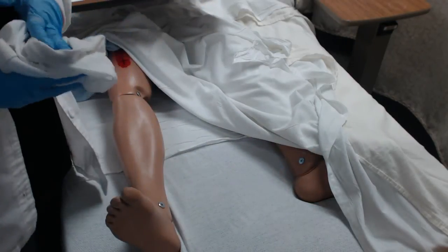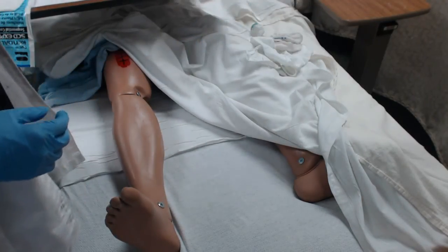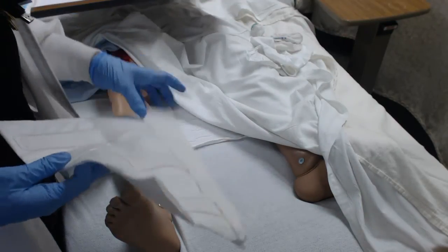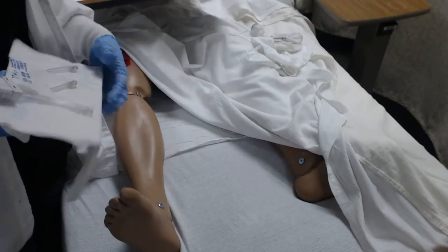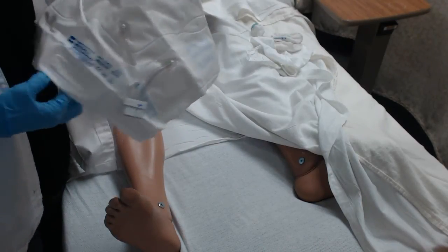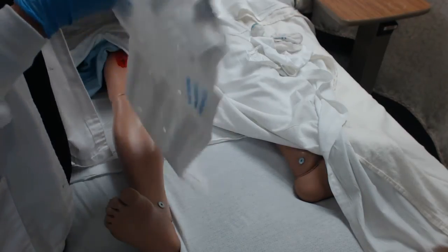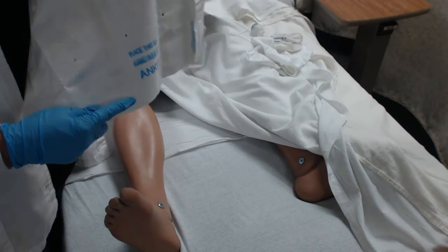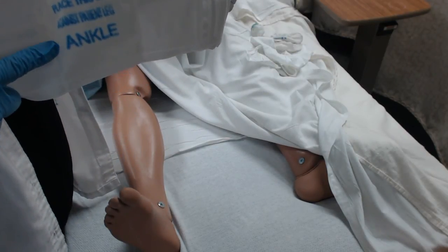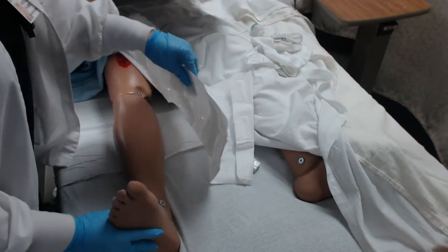So then there are Venadines or SCDs. Many different people call them different names. It depends on what company produced them. So you may hear those interchangeably. These are actually, says right on it, Kendall SCDs. These would be measured as well and fitted on the patient. This side actually says ankle, so that would be the side that we're going to place to the patient's ankle.